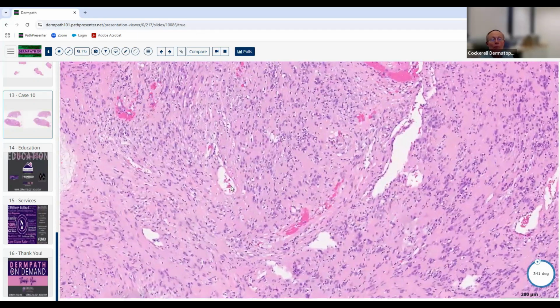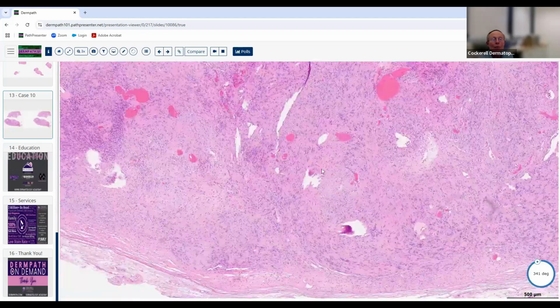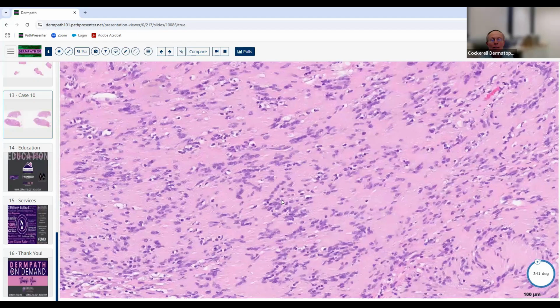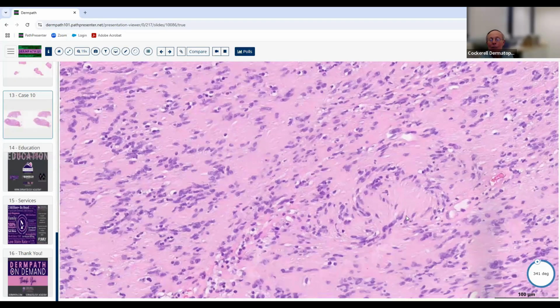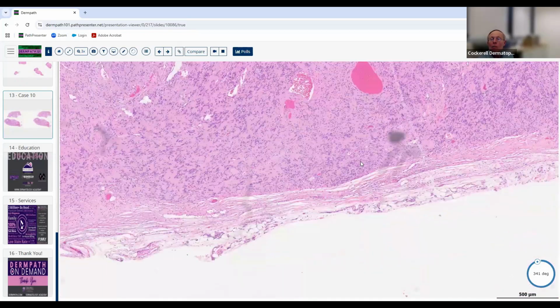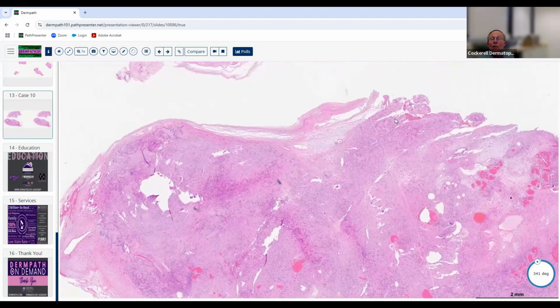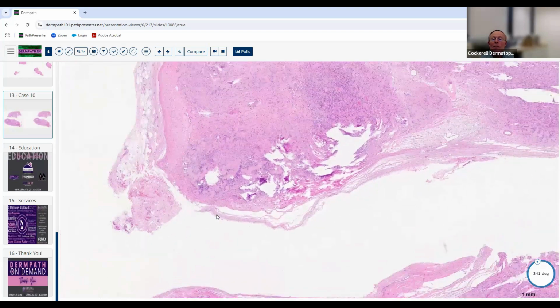And then a couple of other things that help you: if you see these thick PAS positive linings around blood vessels in the lesion, that's pretty classic for neural differentiation. And then if you see these structures right here, where it looks like two little armies lining up to charge one another across this acellular area, these are Verocay bodies in an Antoni A neurilemmoma, and you've got the diagnosis here. One other final teaching point about a neurilemmoma is you'll often see the pre-existing nerve twig at the periphery that led to the lesion. I don't really see it here, maybe here. Well, not really seeing it too well here.